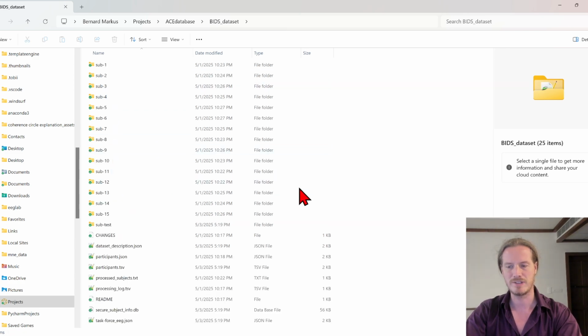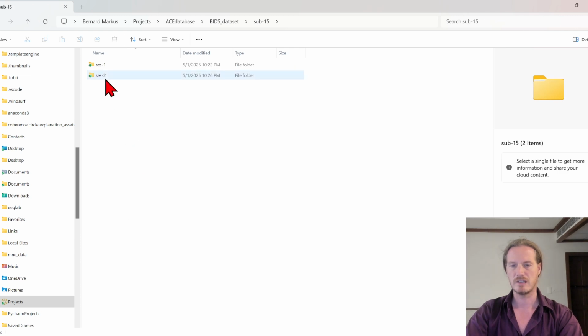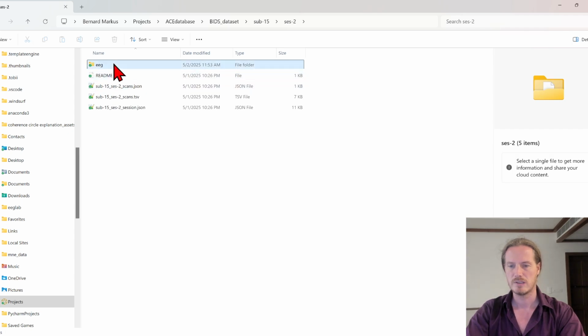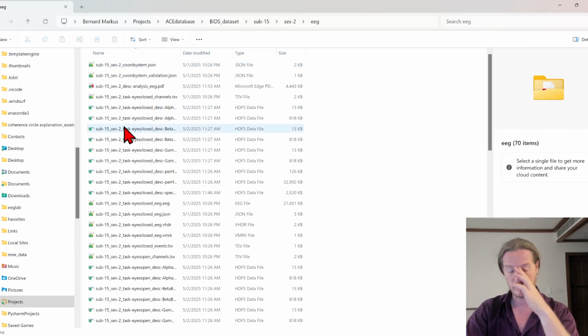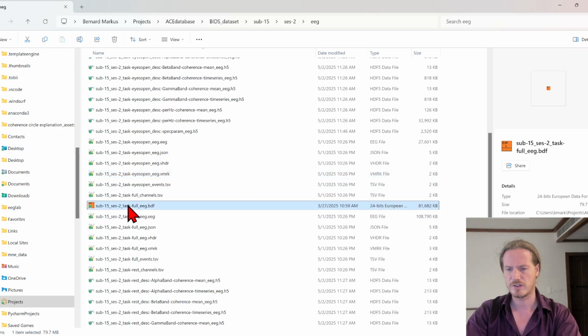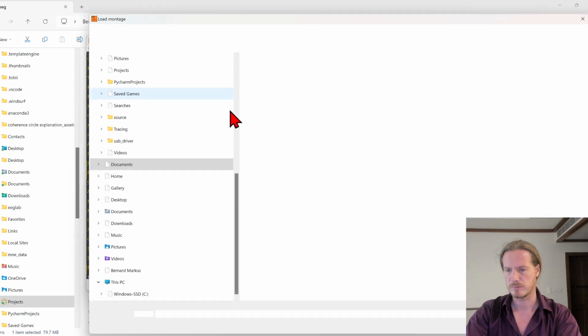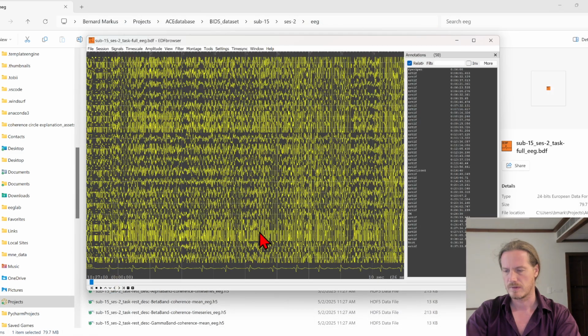And so now all of the subjects, instead of having their name, they're called subject 1 and 2 and 3, etc. So let's take a look at, for example, subject, let's say 15. Subject 15 has 2 sessions, and in session number 2, all of their data, so every session has the same structure, and the original EEG data is just this one file. And if we look at that one file, we will see that I have to load a montage. There we have the data.